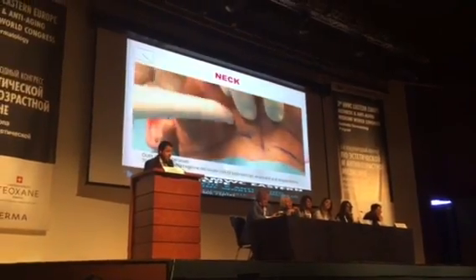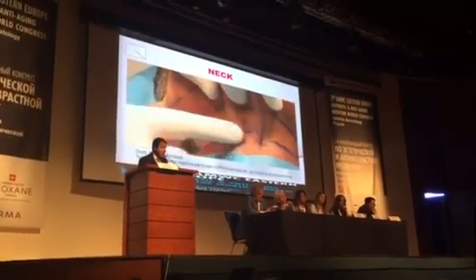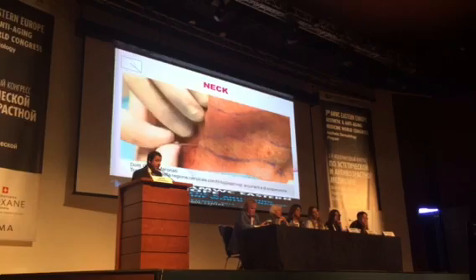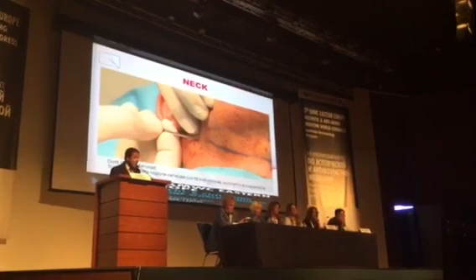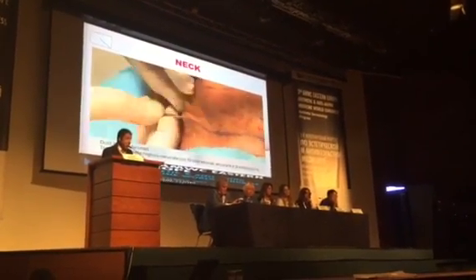Now I'm using a cannula for the infiltration of the cervical region. This cannula is 25 gauge, 7 centimeters. And more or less I use between 7 and 10 cc of lidocaine to make the anesthesia in all the neck. Then I start with my 2 needles that are joined.